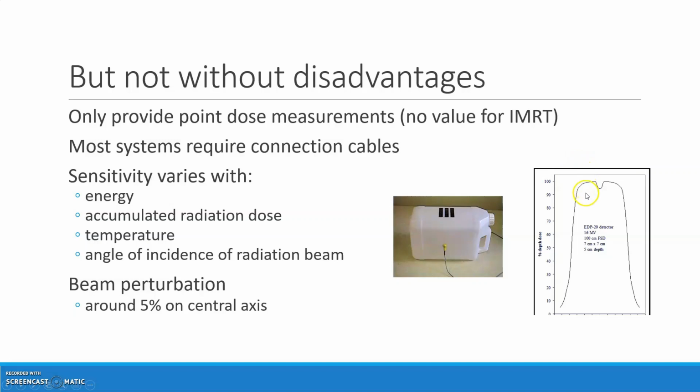So you can't use these on a day-to-day basis, otherwise we would underdose part of whatever it is that we're trying to treat. So we can't do that. So that's something to consider as well. We're going to reduce the dose by about 5% underneath the diode.